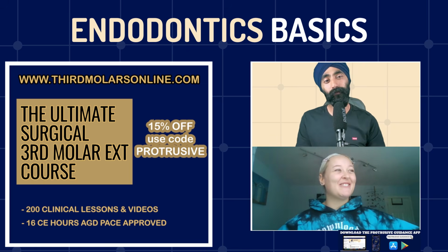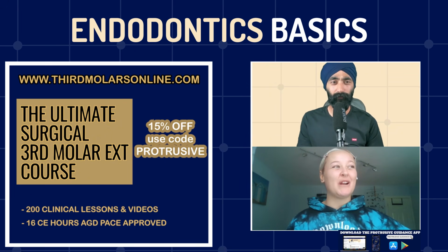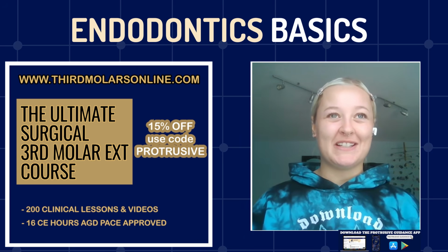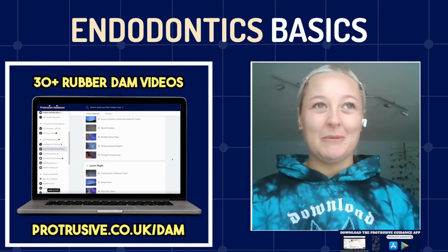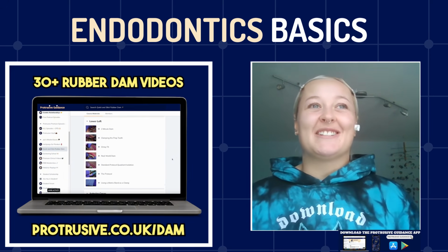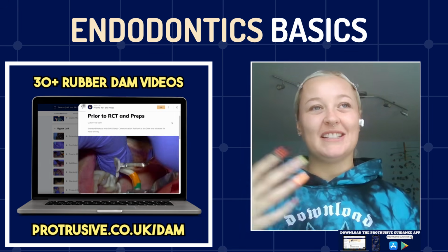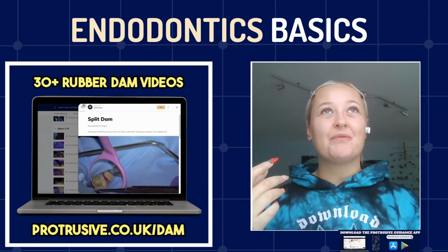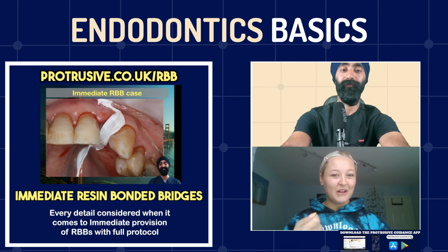And just on the back of that, as a bit of gossip, I remember I did a locum in a practice. I won't say where or who. But they were using Milton, like baby Milton, which I thought was subpar, but I'm just there for one day. It's not like I worked there permanently. They were using Milton and chlorhexidine for their root canals. There was no rubber dam in sight. And when they were taking an inter-appointment radiograph, they put a clamp on the tooth and then took the radiograph.